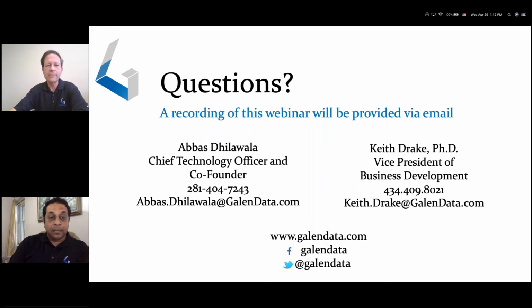Here's a good one. I'm curious about interfacing with embedded systems. Can you share any information on how authentication and data transfer works with the API? Yeah, sure. So the authentication can be done many different ways depending on the need. We can do interactive applications or interactive devices. You can even use user authentication, so the user is actually doing the login. Behind the scenes, we use that to create essentially OAuth-based tokens that can be exchanged between systems to do the full authentication.